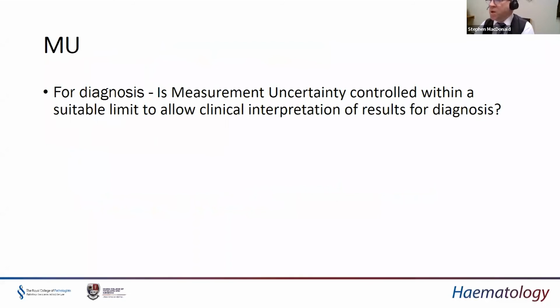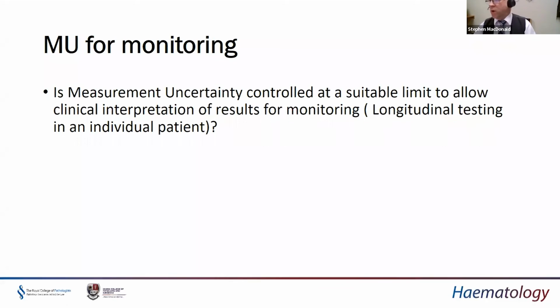period of time. So for diagnosis, we compare things such as reference intervals and clinical cutoff points, some of which are locally derived, some of which are nationally derived or guideline based. And the extent to which we vary our patient results varies from those expected reference intervals will determine what the probability is of them being clinically unwell. The uncertainty associated with the assay will have a massive impact on that. And it will also have an impact on how two different serial results in an individual patient changing over time is interpreted.